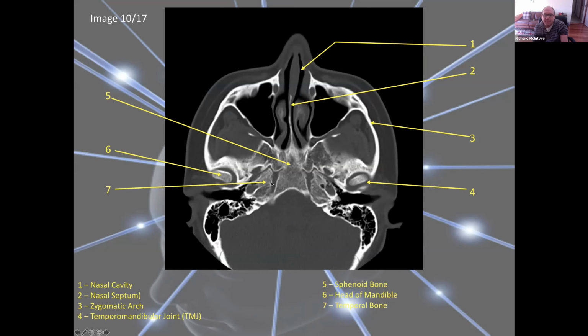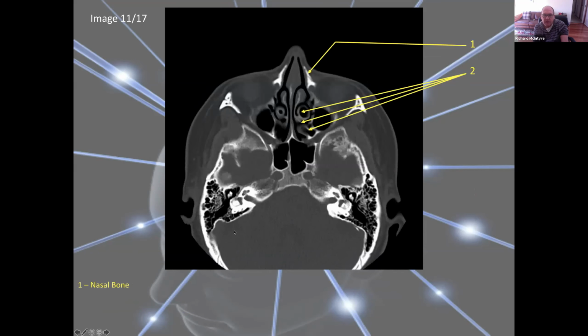We're just getting into the temporal bone now. And can you see here, one thing that I like to point out is the temporal bones. The CT shows amazing detail of these temporal bones. This is a little nerve coming out. It's the 7th and 8th nerve coming out of the brain. But the CT really shows the temporal bones around that nerve well.